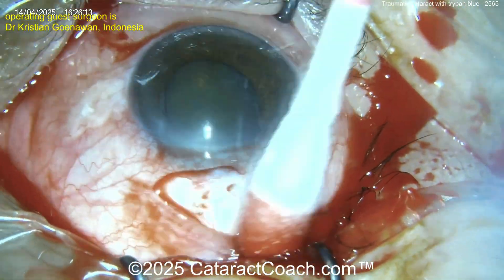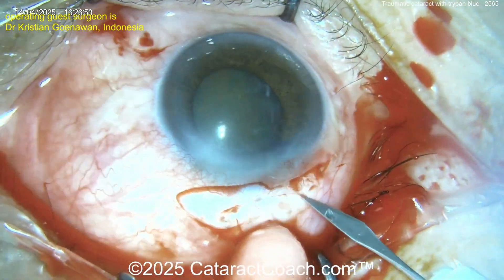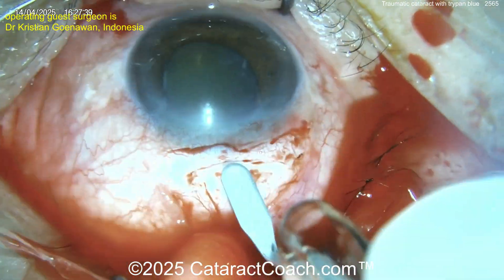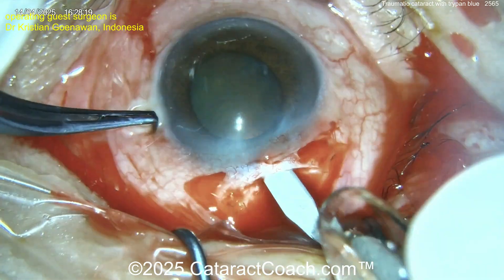The surgeon is making an incision in the sclera — here we go, crescent blade. The technique: half scleral depth groove, a little bit of a frown incision. Yes, we've sped up the video.